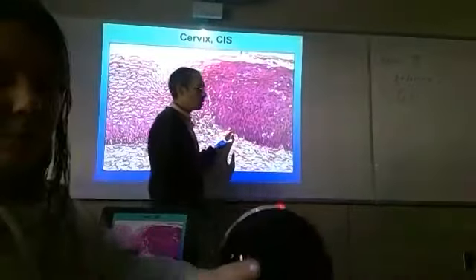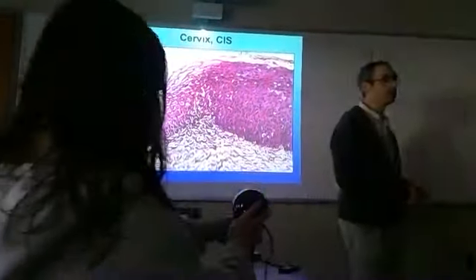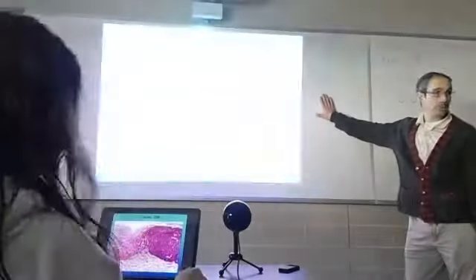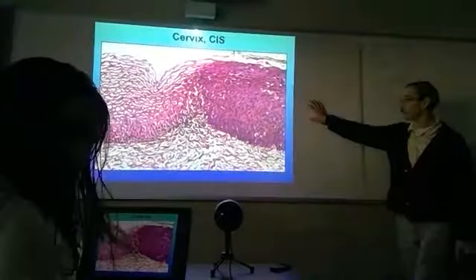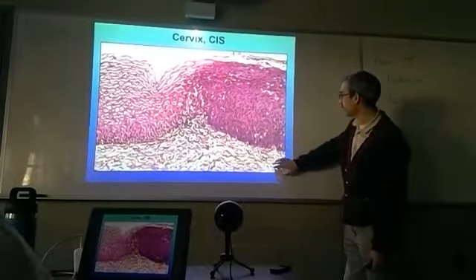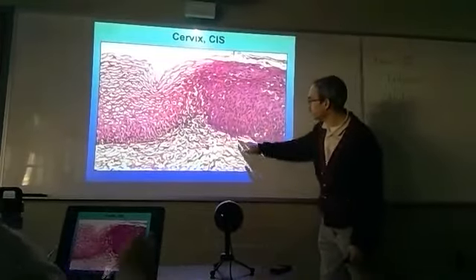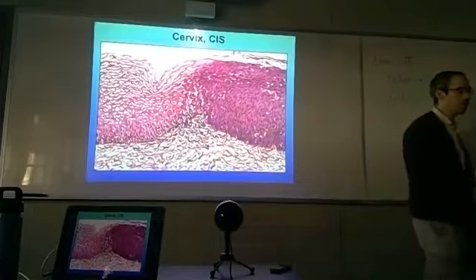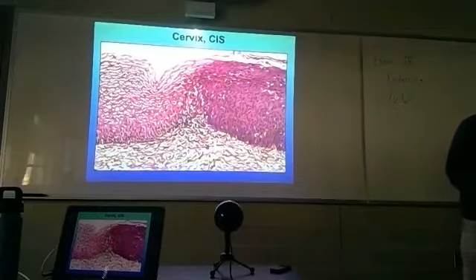Over to the right here, we have an example of a severe form of cervical dysplasia. Again, most of the time this is caused by an HPV infection. Again, there's the epithelium, basement membrane, and the subepithelial tissues. We look at the parabasal cell layer. Naturally, all the cells are crowded together. They have high NC ratio. That in and of itself is not a problem.